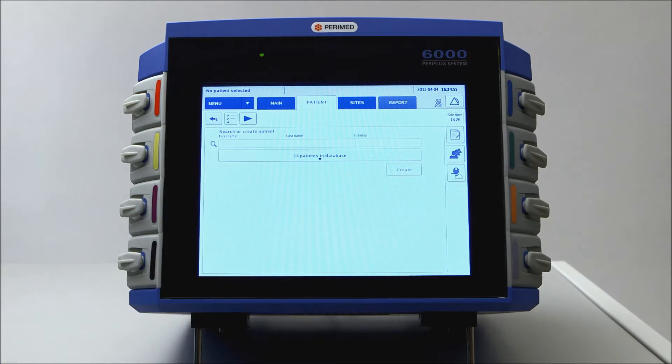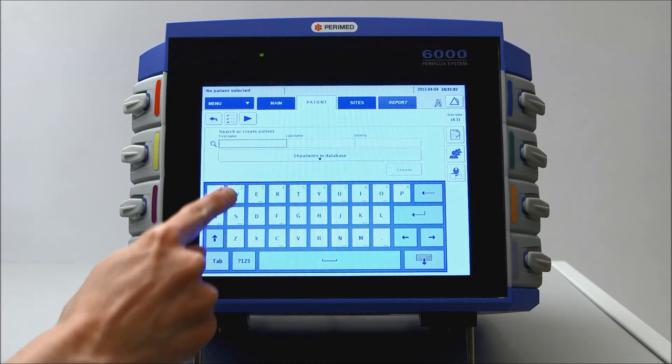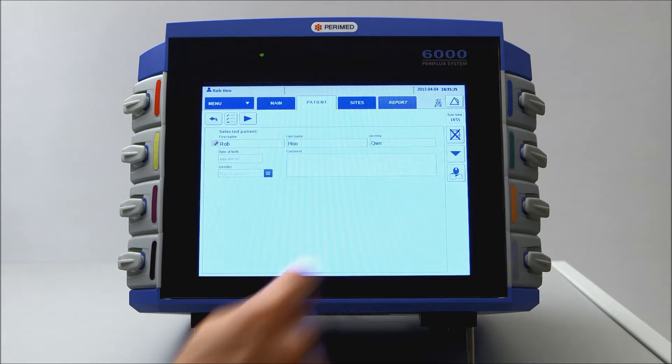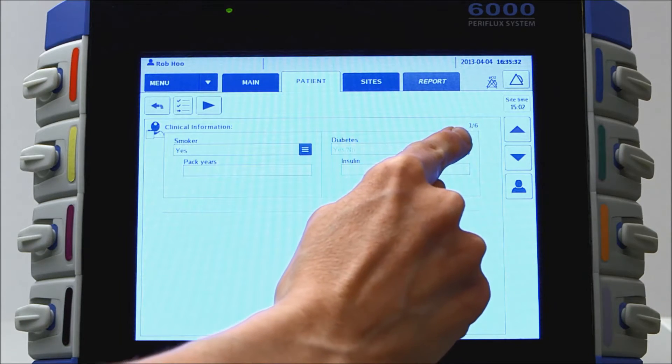Tap the patient's tab, choose an existing patient from the list or create a new entry. You may then tap the clinical information icon to enter relevant information about the patient.